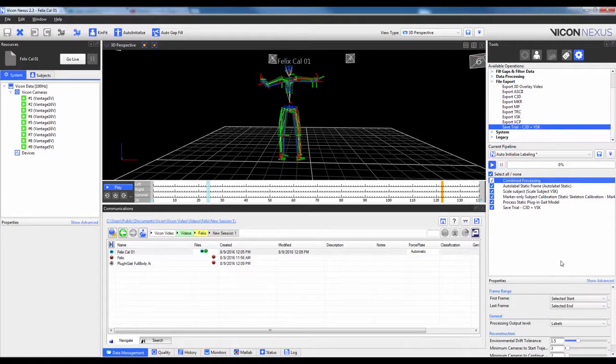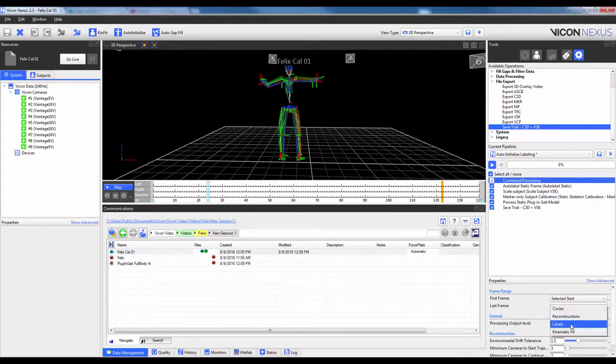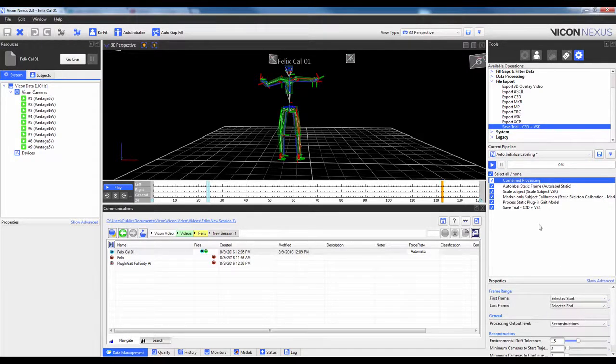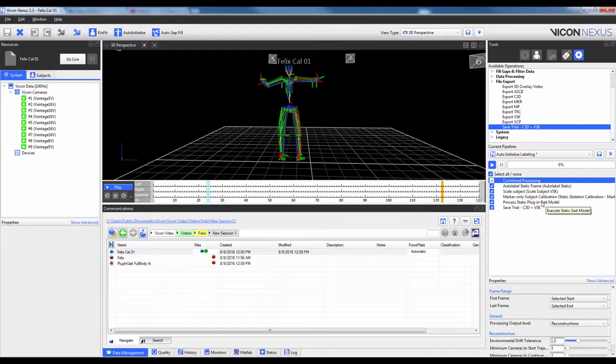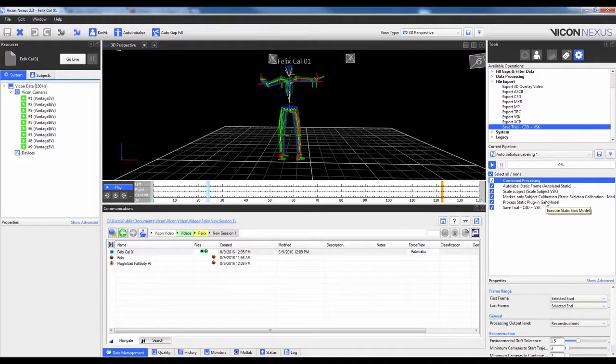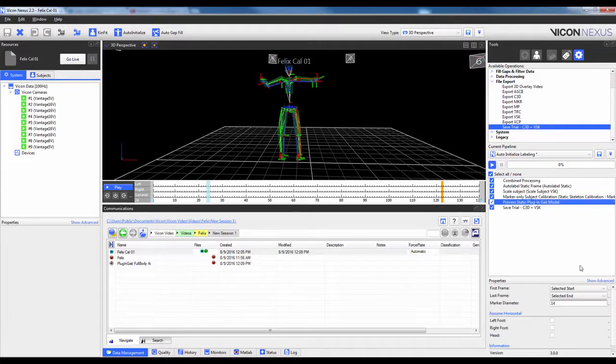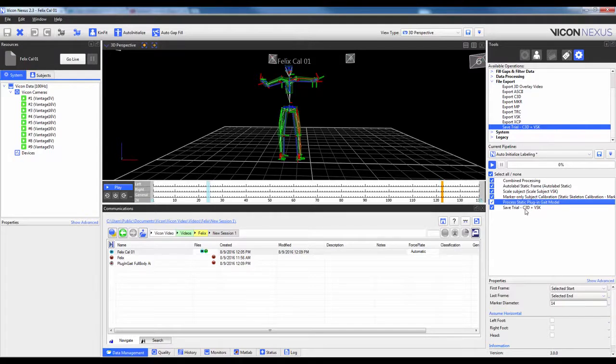So that's up at the top. I'm going to highlight Combined Processing and just make sure that the Processing Level is actually set to Reconstructions. Then I'm going to have the three steps of Auto-Initialize. Then I'm going to have it Process the Static Plug-in-Gait Model. Again, if you need to, go ahead and change any of the settings here. Then I'm going to have it Save the Trial.